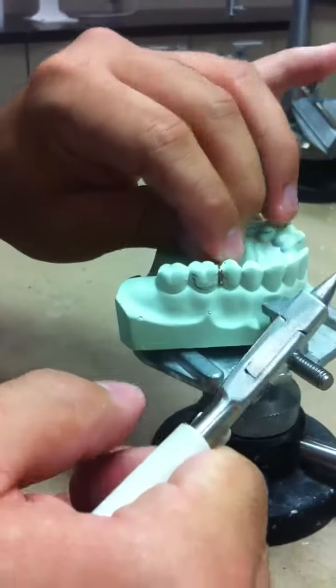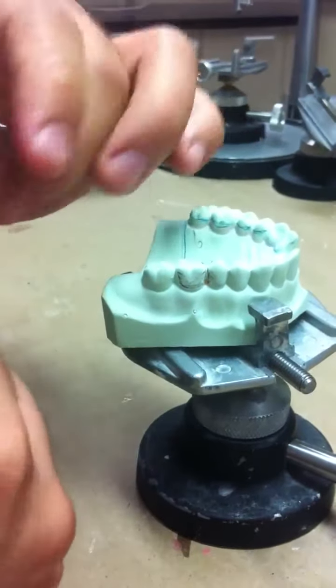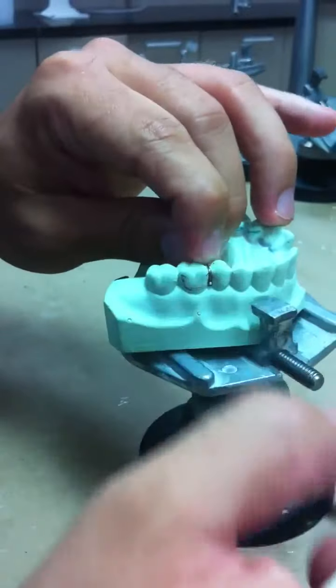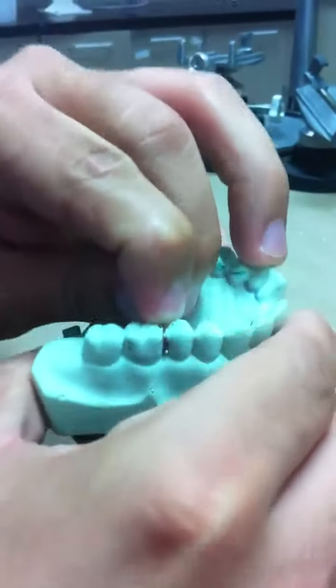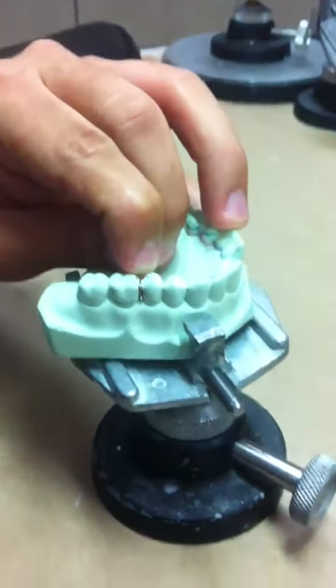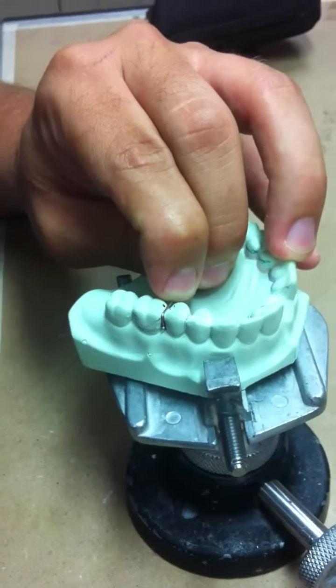Make your bend just below the mark. Again we have marked it where we want to make our bend.